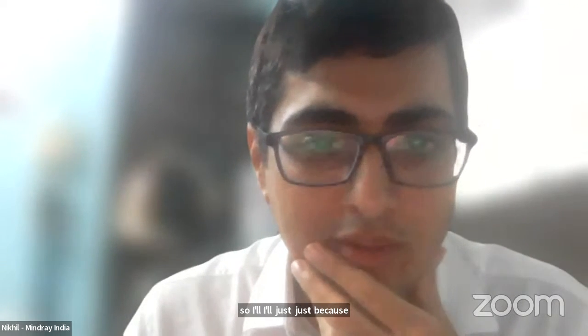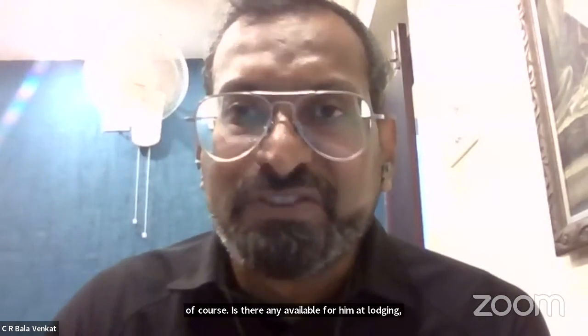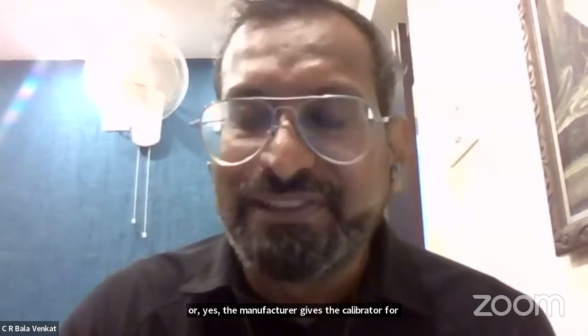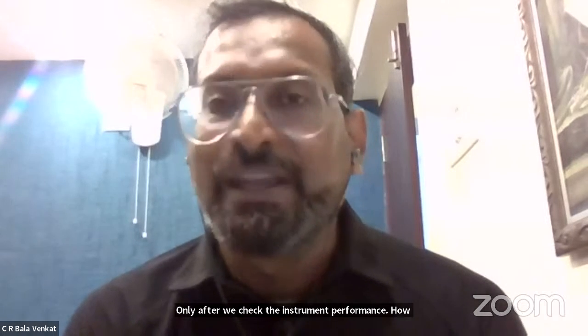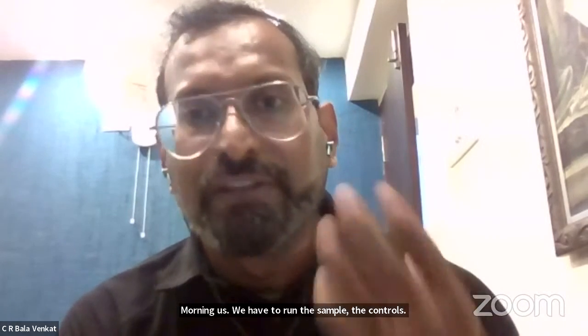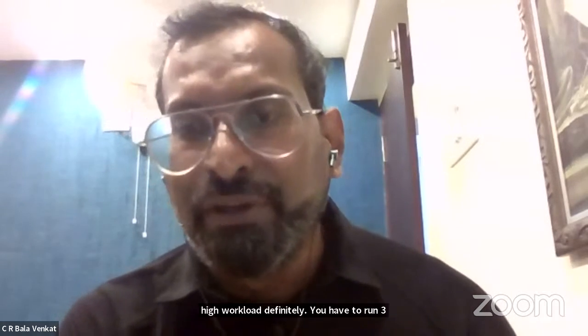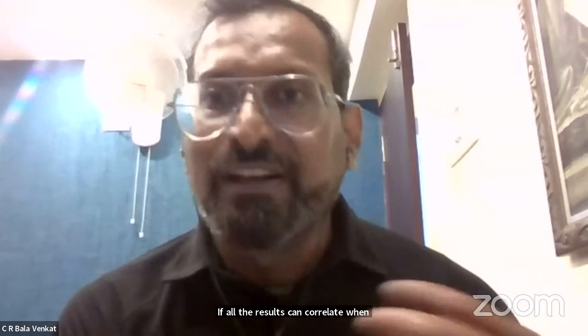Who checks the controls? Our lab staff should check the control because it is run on a daily basis. When we release a result, any sample from the lab is released only after we check the instrument performance, how it is working. So in the morning hours we have to run the controls. We have to run 3 controls if you have a very high workload: low, medium, and high. When all the results correlate and fall in range, then you can start running the samples.